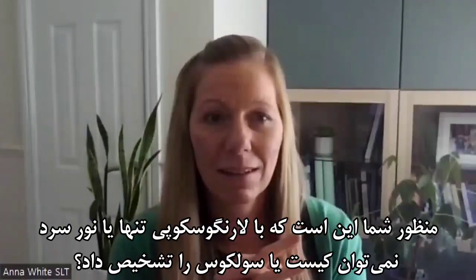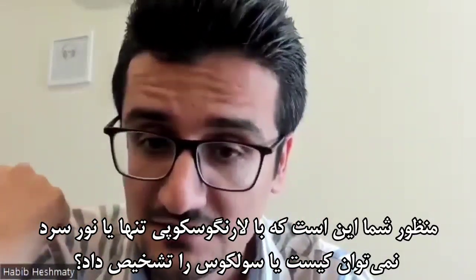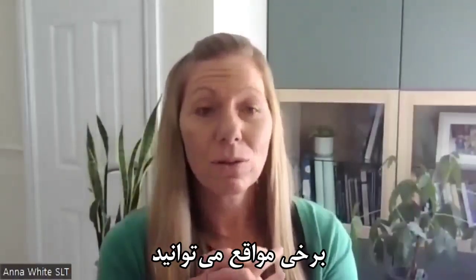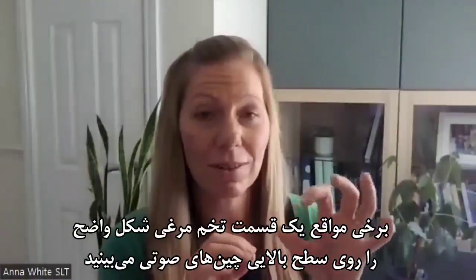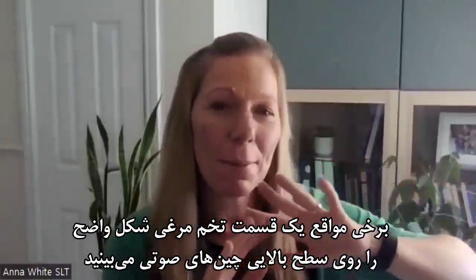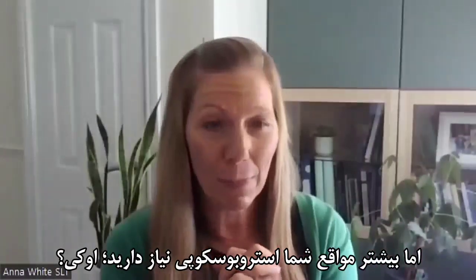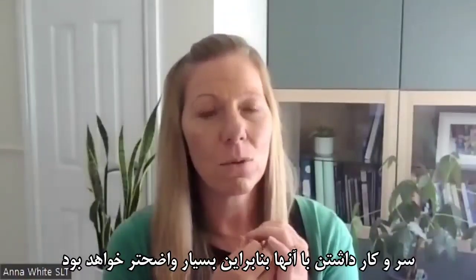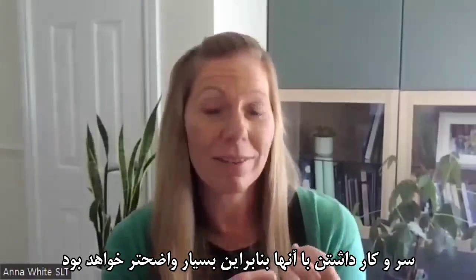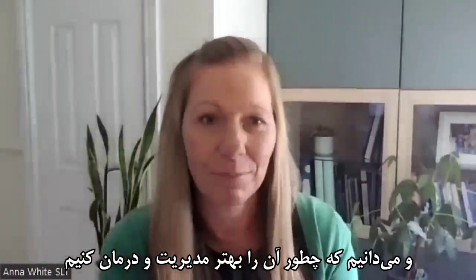So we can diagnose sulcus and cyst with laryngoscopy, cold light? Sometimes you can. Sometimes you'll see a really clear sort of egg shape on the top surface of the vocal fold. But most of the time, and to be more certain, you need stroboscopy. So it's much more clear what you're dealing with. And obviously, if we know what we're dealing with, we know what we're treating and how to manage that better.